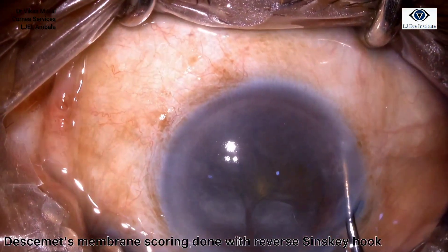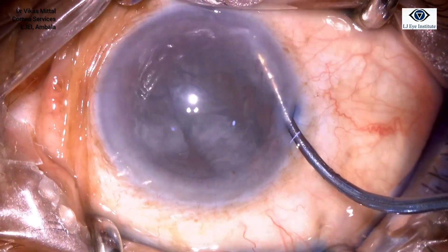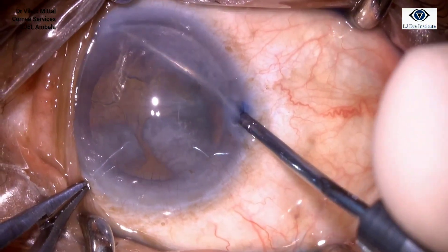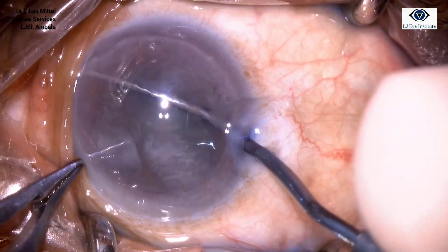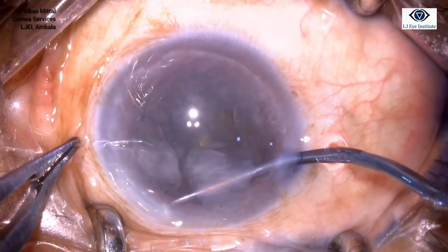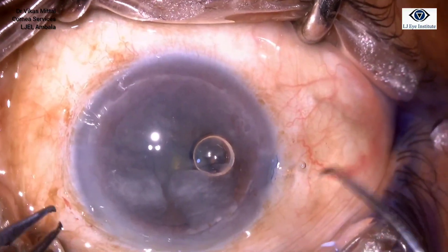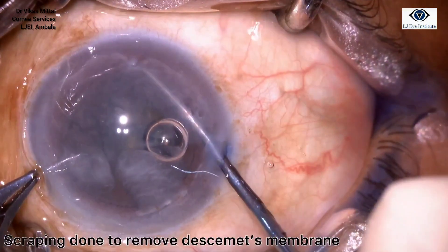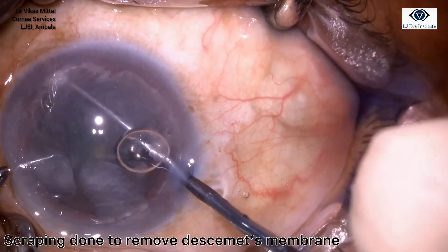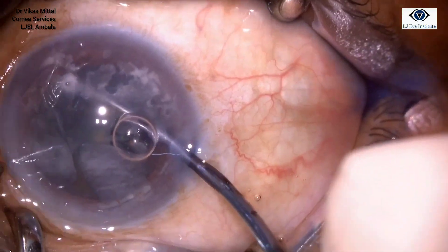Now we score the Descemet's membrane with a reverse Sinskey hook. A more peripheral approach is taken with the aim of removing the DM in one go along with the deposits. As we try to scrape the DM, it is not coming off so easily — rather, it is tearing up in parts along with the deposits.